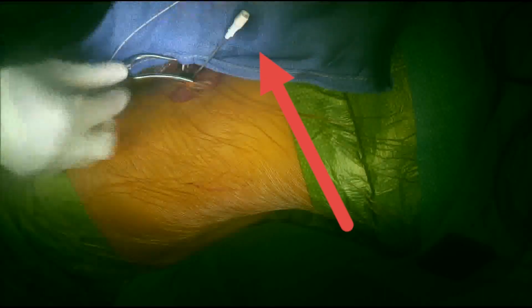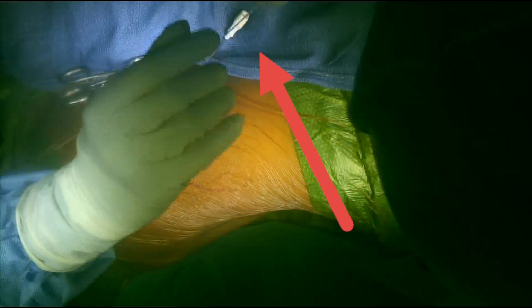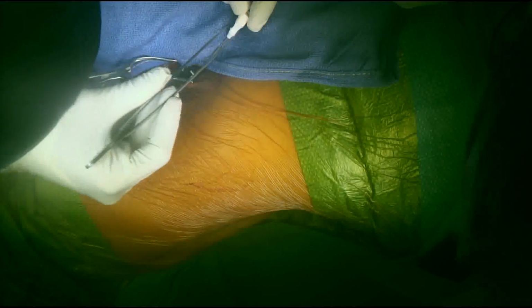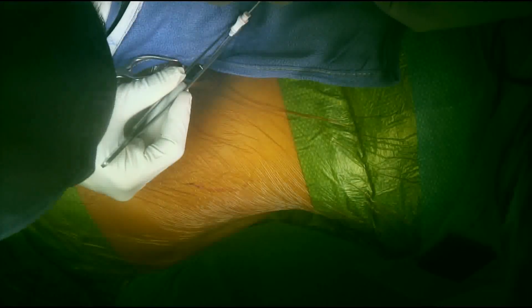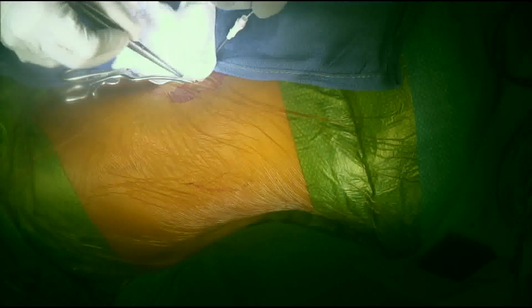You can observe the CSF backflow at the top part of the screen, and this means that you are in the intrathecal space and you are ready to insert your spinal catheter. If the patient only has lower limb spasticity with no upper limb involvement, the tip of your catheter should ideally reach the top of the lumbar spine up to T6.